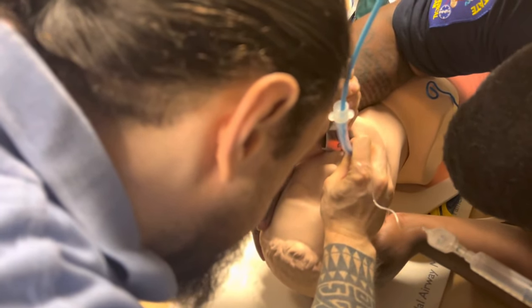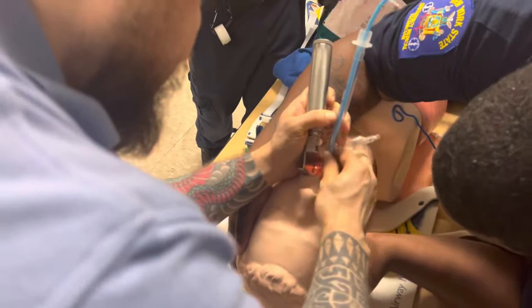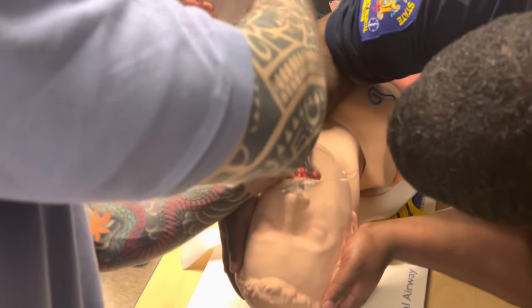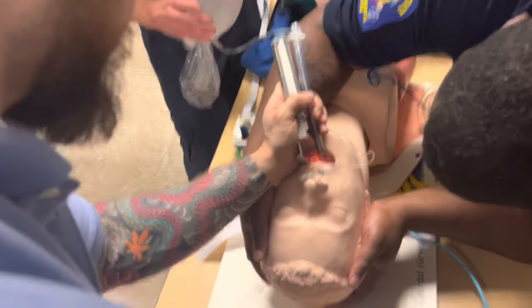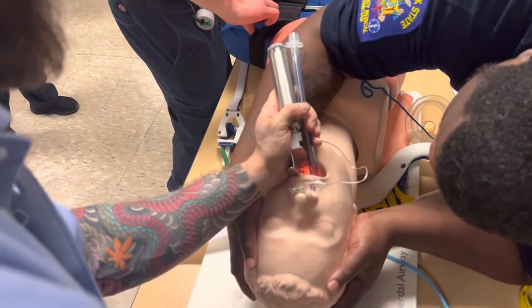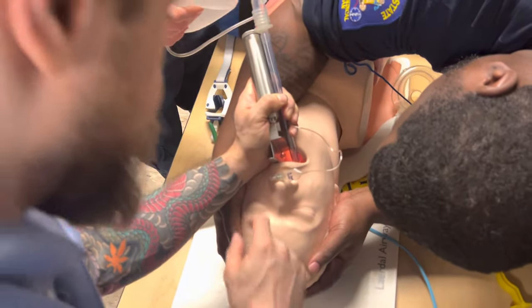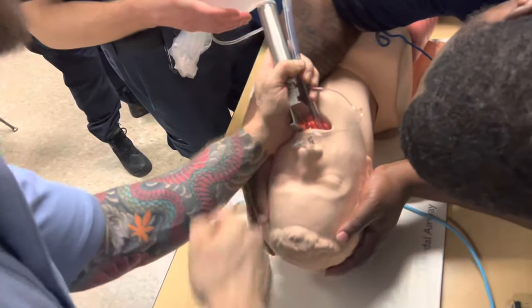Once I see it go past my vocal cords, I'm going to inflate the cuff. I saw it go through. Now when I take out my bougie, I'm going to do it anatomically towards the feet. Then we need to put on the capnography - it might be in the ET tube kit. The reason I keep my blade in is I want to make sure that when I pulled out the bougie, I did not pull out the tube with it. I see it's in.